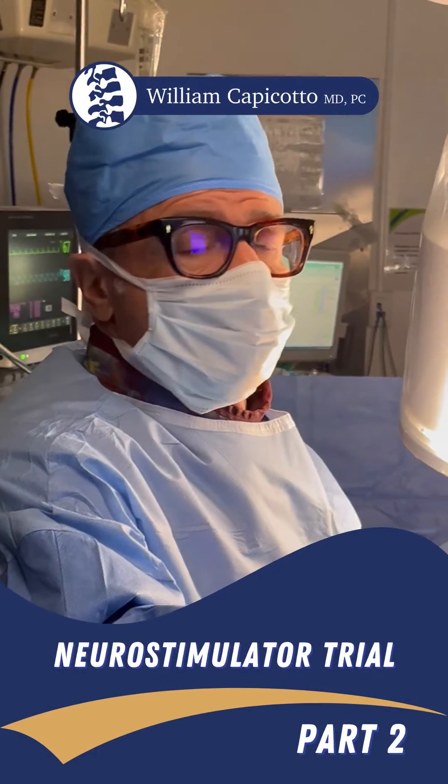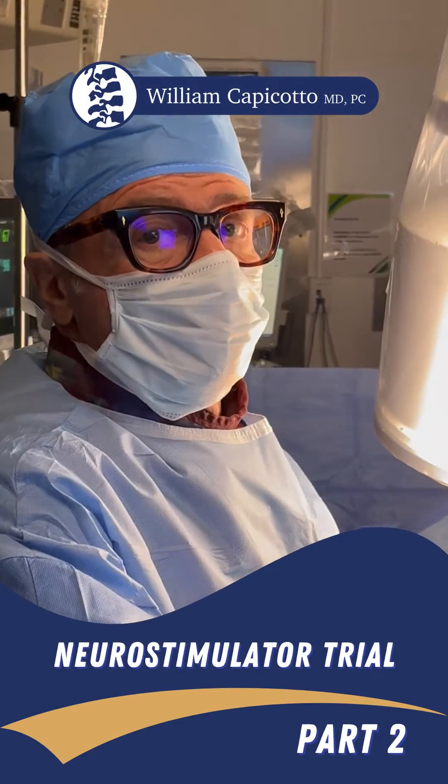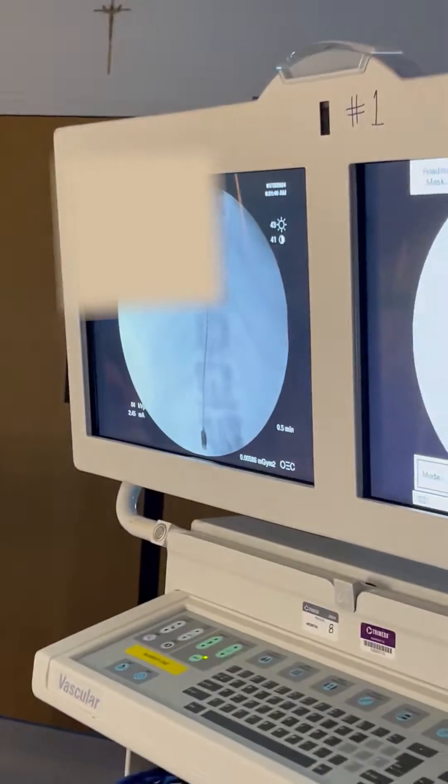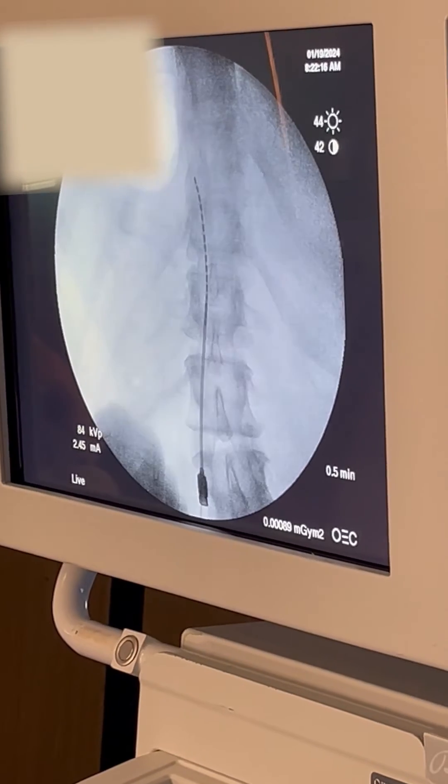All right, so now the electrode is in the spinal canal — epidural, outside the dura. And here we have the picture. Keep that camera rolling there, giving you real time.